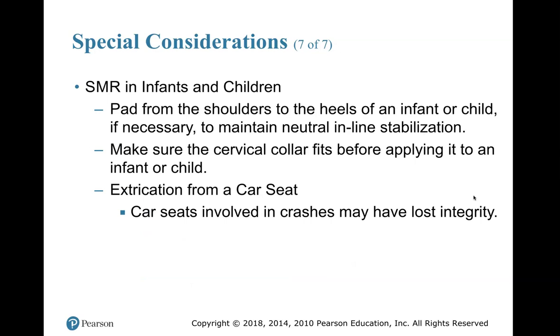Infants and children. Pad from the shoulders to the heels of an infant or child if necessary to maintain neutral inline stabilization. Look at that patient. If their spine is not in line and stable, you can pad underneath them. Make sure the cervical collar fits before applying it to an infant or child. There are infant cervical collars out there. You need to make yourself familiar with those.